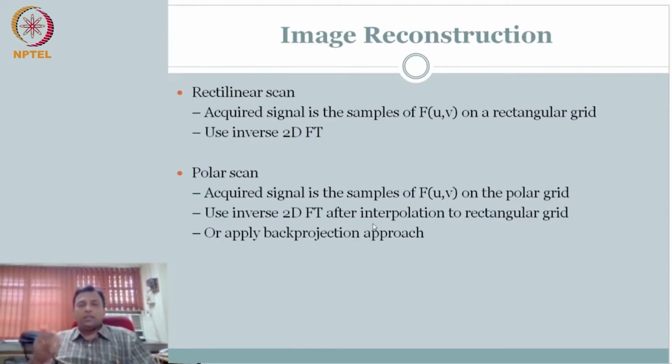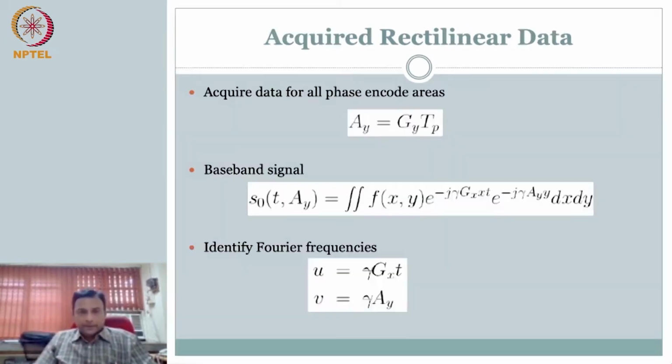All of this reconstruction from Fourier to image we also did for CT. So several of those algorithms can quickly guide you as to how you can do the inversion. We tried convolution, remember. The same things can be applied here, nothing secret about it. The only thing that I'll do is refresh the equations we have and how we start to look at the data or organize the data in a standard format.